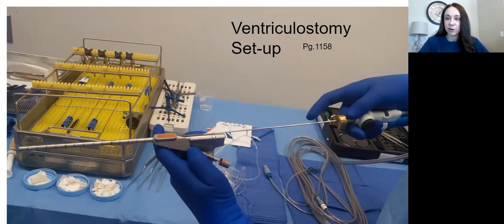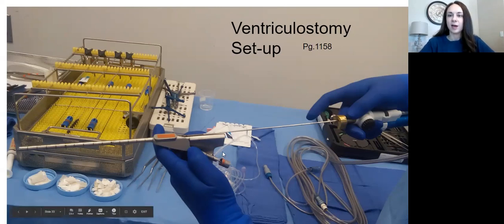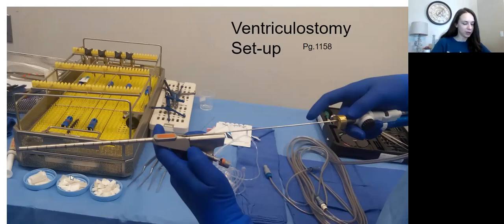Ventriculostomy is minimally invasive. So we want to get into that ventricle without cutting into the brain, right? So we are going to do the least invasive incision right in between certain areas, so we're not damaging any brain tissue. We're going to go directly into that ventricle. So ventriculostomy setup, it's like an endoscopic version of brain surgery. It doesn't look like much right here, but the small skinny tube is the only working instrument that is going to go into that ventricle. So that is your ventriculostomy setup.